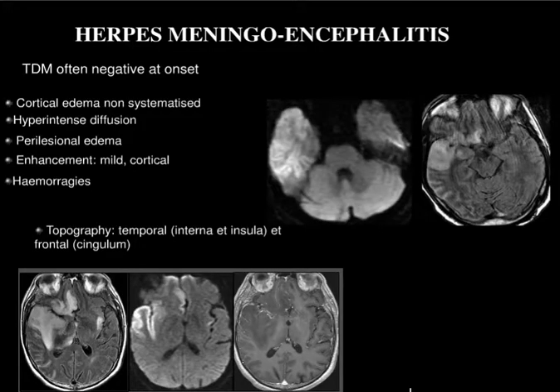And then, of course, you know that MRI is very, very useful and has to be done when you evoke the diagnosis of herpes meningoencephalitis, because the CT scan is often negative at the onset. The MRI can show this typical lesion of the temporal lobes or sometimes of the frontal lobes.